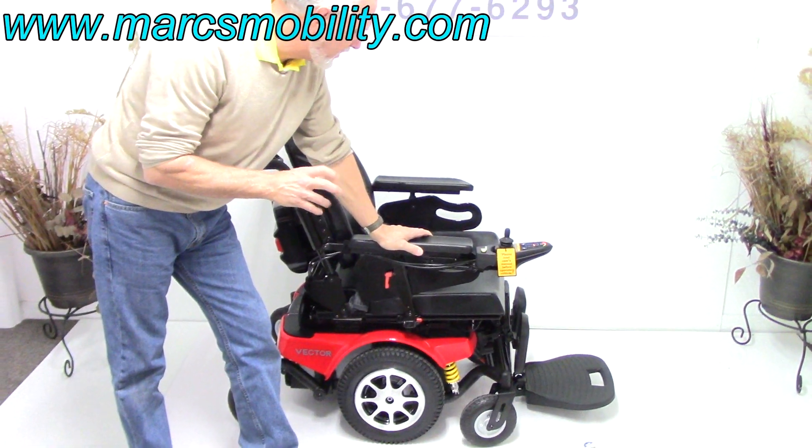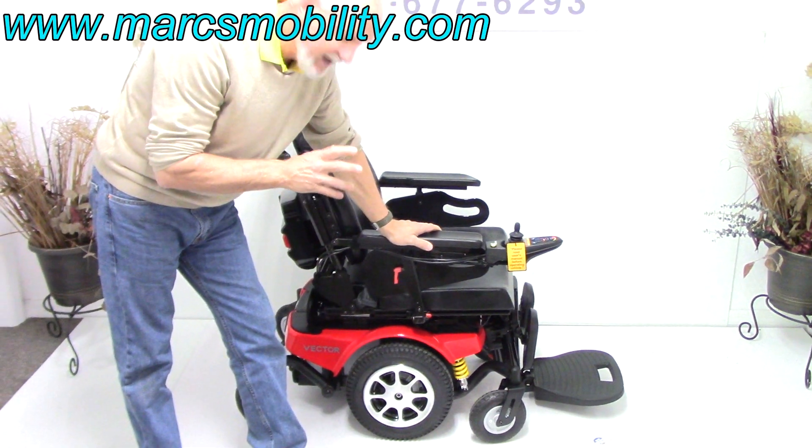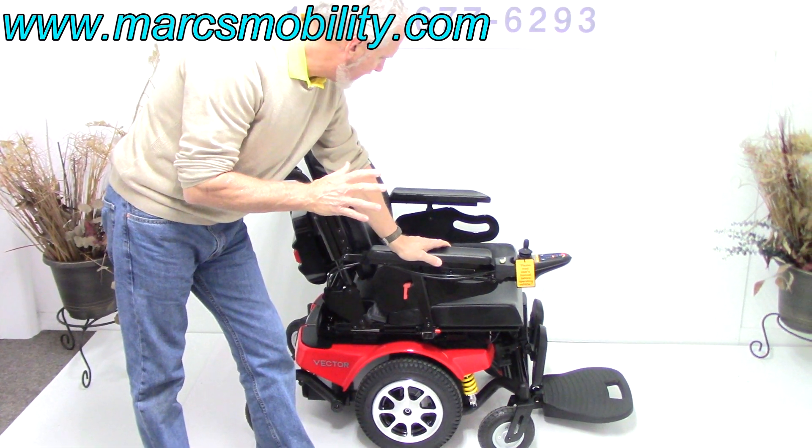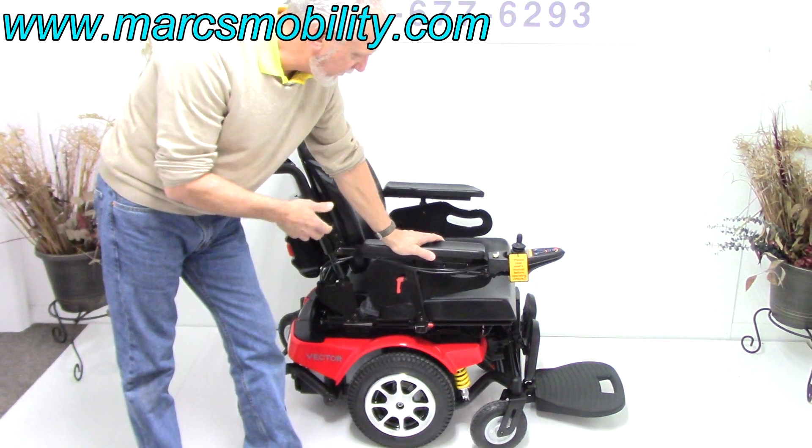This is a Meritz power chair, called the Merit Vector power chair. This power chair has less than two miles on it. It's in brand new condition — it was delivered, never used.